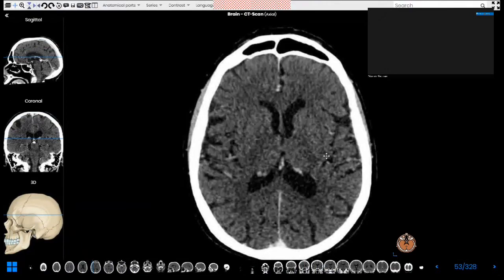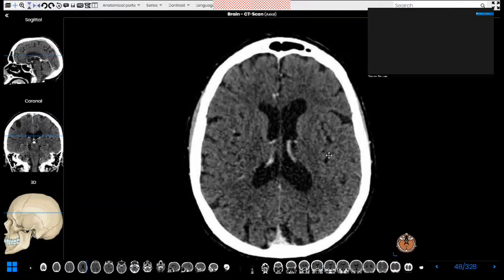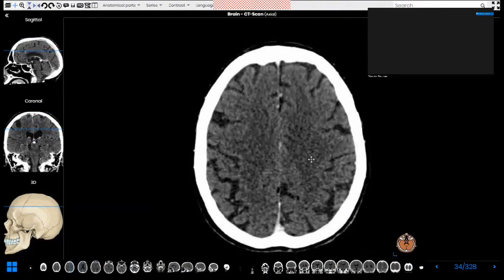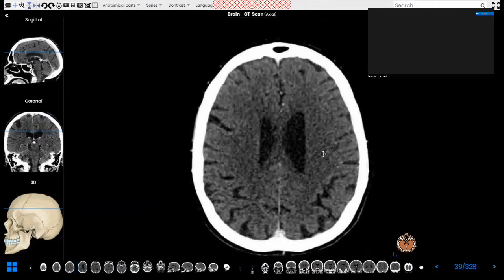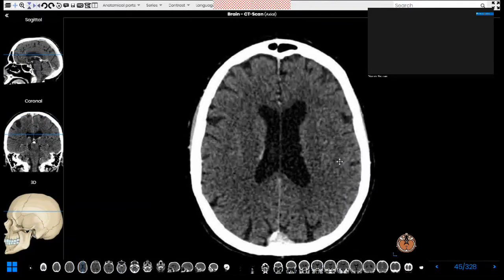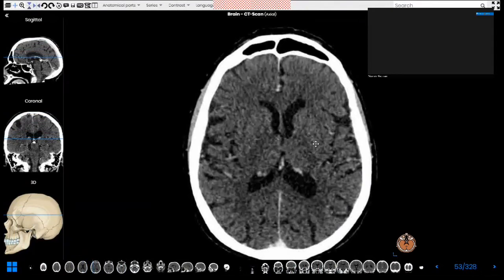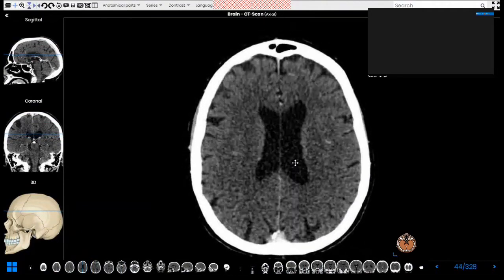When we scroll up above the ventricles, this is the centrum semiovale, and this part of white matter is the corona radiata. To sum up: the gray matter of the brain is divided into superficial and deep. The superficial gray matter is the cortex, which lines the cerebral hemispheres. The deep gray matter structures are the basal ganglia — the caudate, globus pallidus, and putamen — as well as both thalami. The key white matter structures are the internal capsule, external capsule, corona radiata, and centrum semiovale.